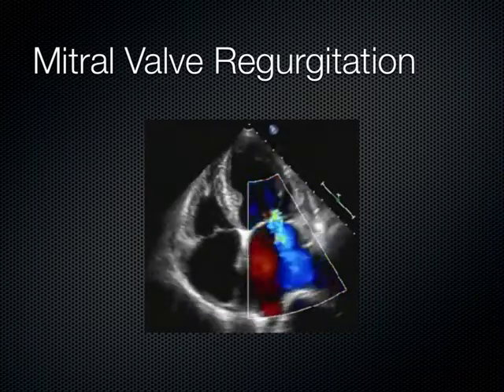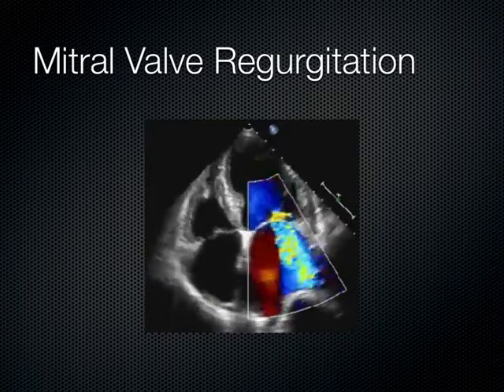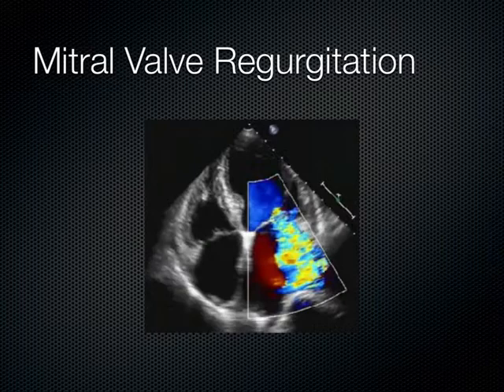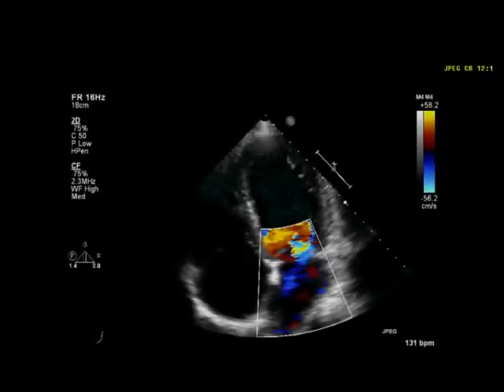And we do this in the apical 4, not the parasternal long, because recall that when you work with Doppler, you don't want the Doppler to be at a 90-degree angle with the angle of insonation. In the parasternal long axis, where you look at the mitral valve, you're at about 90 degrees, whereas in the apical 4 chamber view, you're closer to parallel. The sound is more parallel with the flow of the blood, and you're closer to an angle of maybe 60 degrees or even less, even 45 degrees. So that's the idea. The more parallel you get, the better Doppler works.